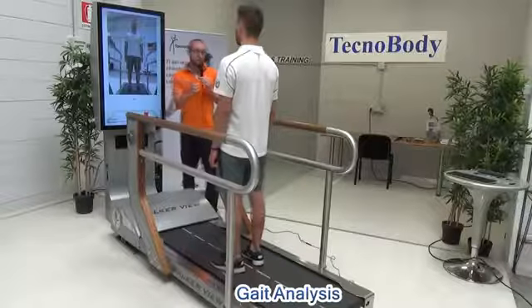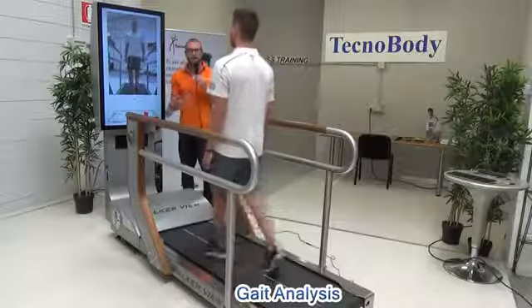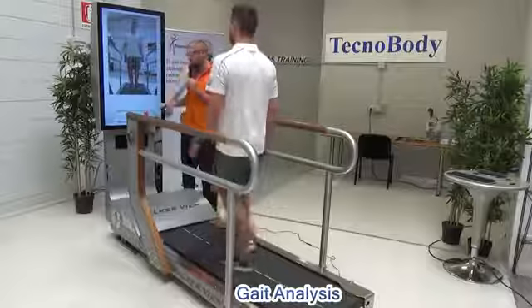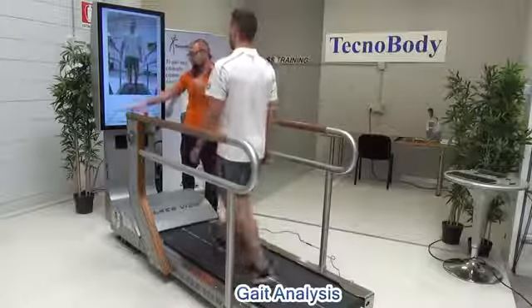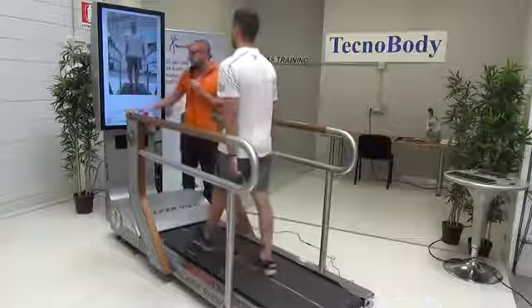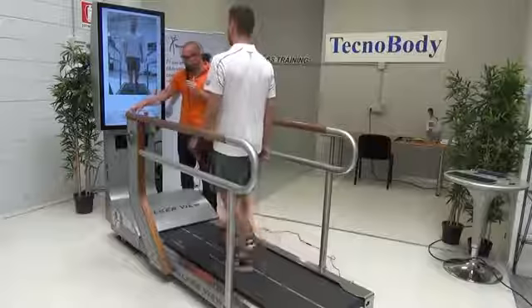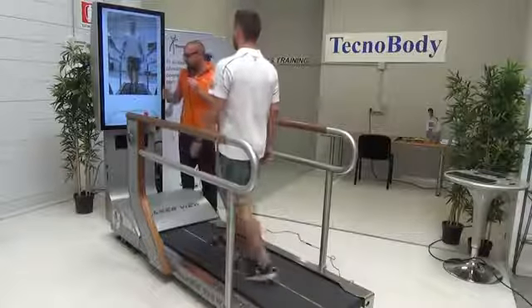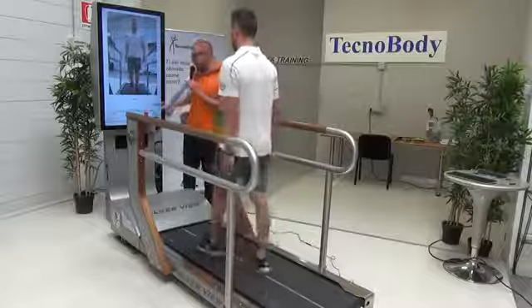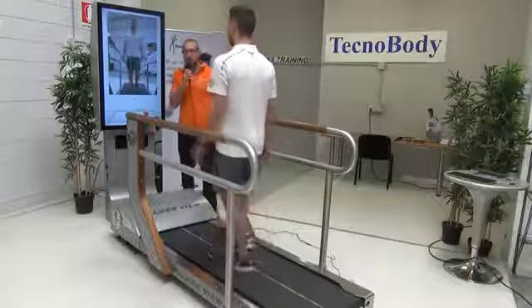As you can see, at the moment of the start of the gait analysis, based on the gender and based on the age, the test is already set with some parameters, basically the speed. As you can see as well, before reaching the speed fixed for this kind of test, there is a little warm-up to arrive to this speed, and then a cool down. During the test, the first part and the last part will not be calculated for the gait analysis.